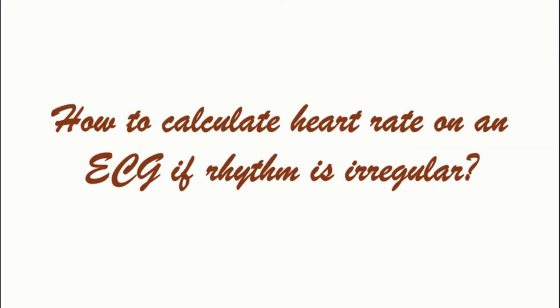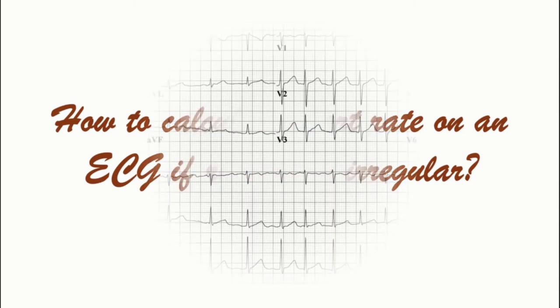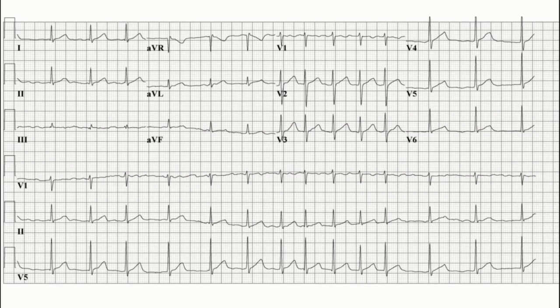Hi, my name is Dr. Nitin and today I am going to show you how to calculate the heart rate on an electrocardiogram if the rhythm is irregular. For example, this ECG has atrial fibrillation and the RR interval is variable.